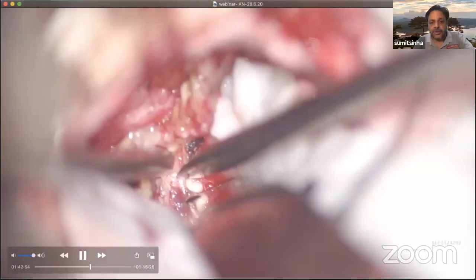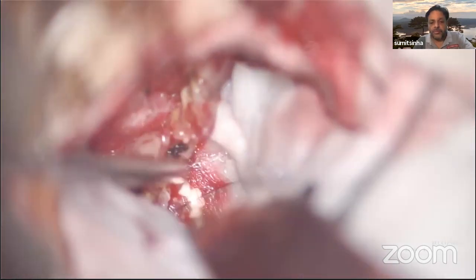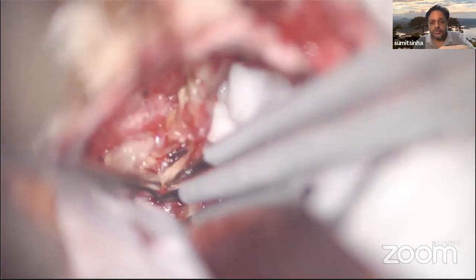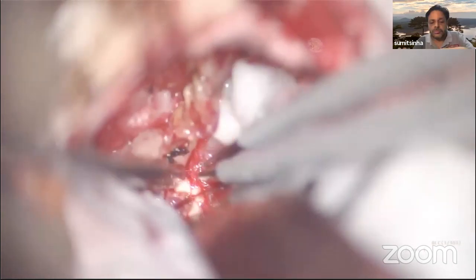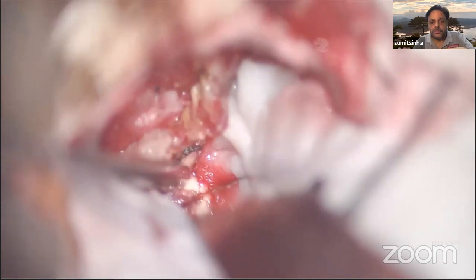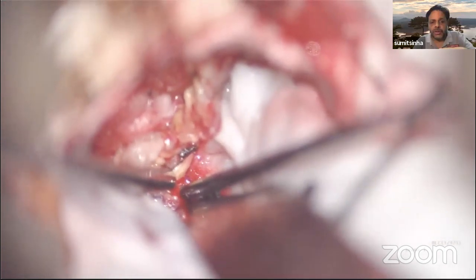You see that here. This is that vein, the mesencephalic vein, and this is the separation of the tumor capsule from this vein. No stimulation over there, but just checking.